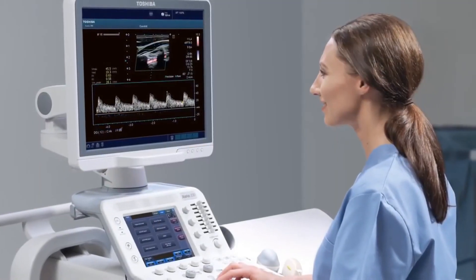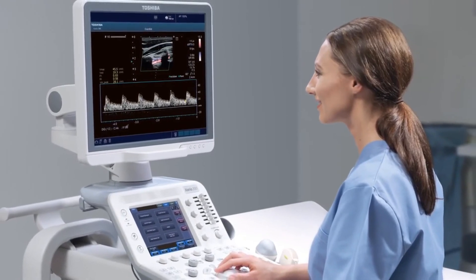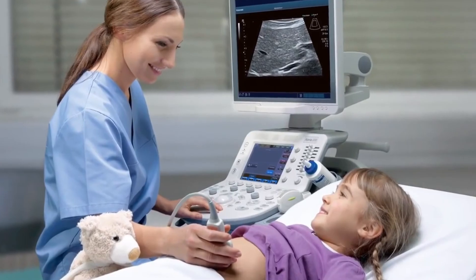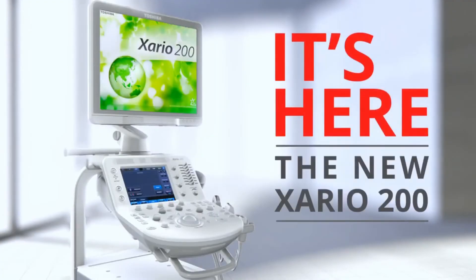The new Xario 200 helps clinicians focus on what matters most — the right diagnosis on all patients. Xario 200. Rest assured. With quality you can depend on.